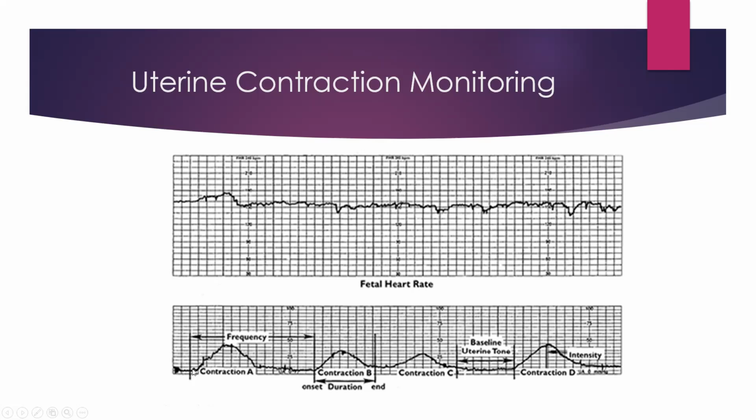Then the beginning of this contraction starts in about the middle of these bold lines. So we can count this first section as about half, and then this would be the end of the second bold line, so another half. So this is about 60 to 70 seconds: 10, 20, 30, 40, 50, 60, 70 seconds long. As far as the frequency, we're going to go from half, so from here to here would be 1 in the middle, and from here to the middle of the second bold line would be 2.5. So our frequency range is going to be 1.5 to 2.5 minutes.